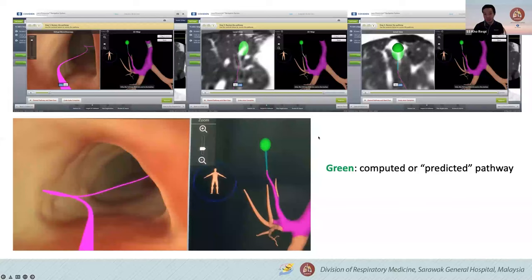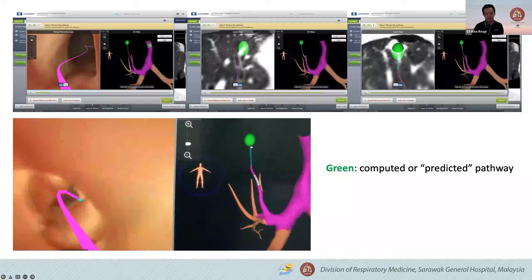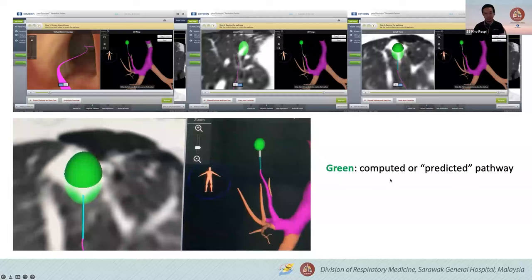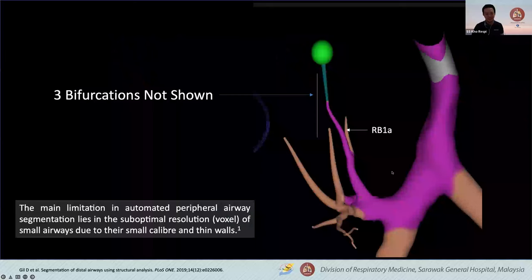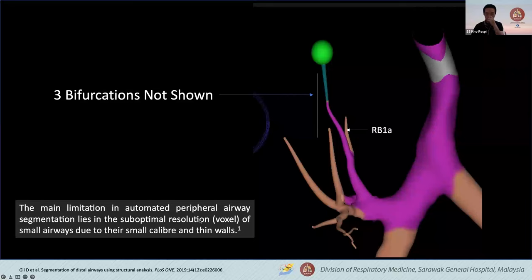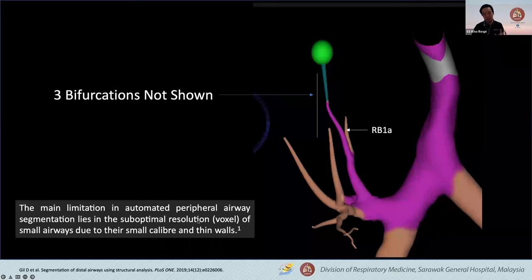Usually we would also put it into ENB to make sure we are correct, but you can see in this region, ENB really performs very poorly. All the areas are green — the computed or predicted pathway — so they can't really give you the anatomy. When you go in with ENB, you really have to trust the computer and follow strictly whatever they tell you. There are at least three to four bifurcations here that are not shown — they can only detect the big airways, which everyone can detect as well. This limitation is mainly at the automated segmentation of peripheral airways in the distal region — the resolution of airway versus lung parenchyma is something the computer just couldn't differentiate. It floods with the lung parenchyma and you can't differentiate it. Only human eyes can actually do that.